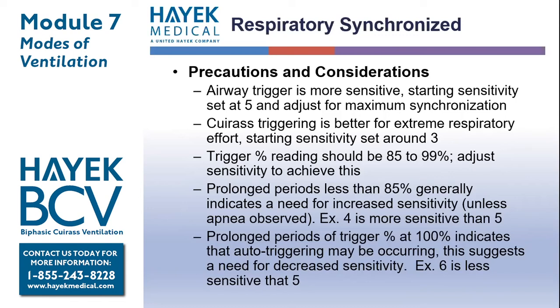Prolonged periods of less than 85% generally indicate need for more sensitivity. Prolonged periods at 100% indicate that there is potential for auto-triggering. Monitor patient closely and decrease sensitivity if indicated.